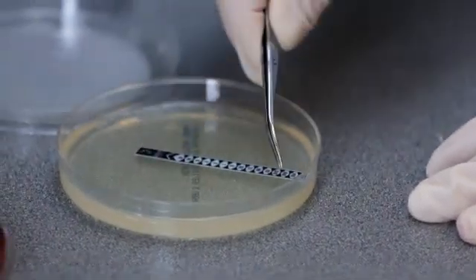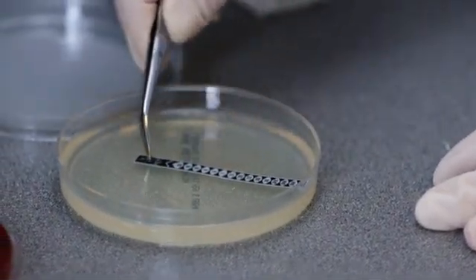If bubbles form under the strip, gently ease them to the edge of the strip using sterile forceps.